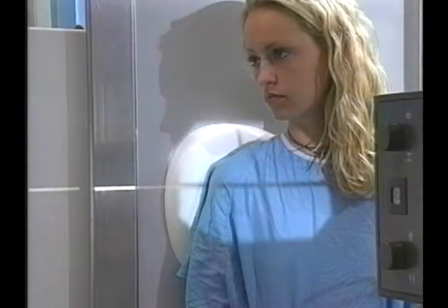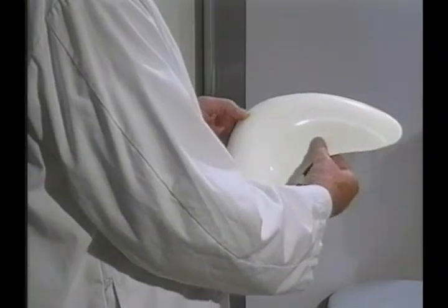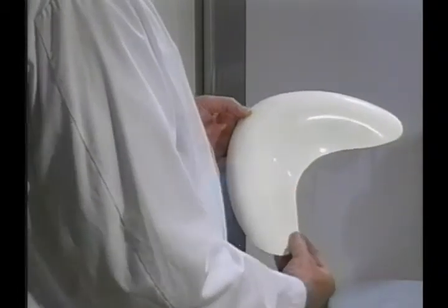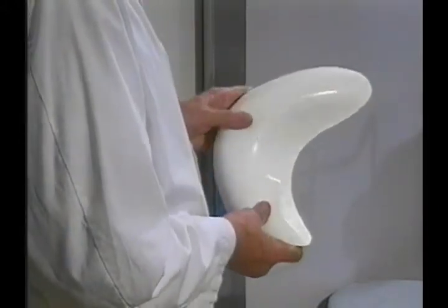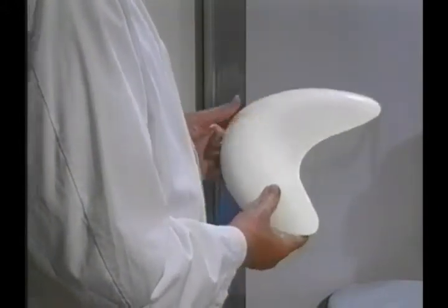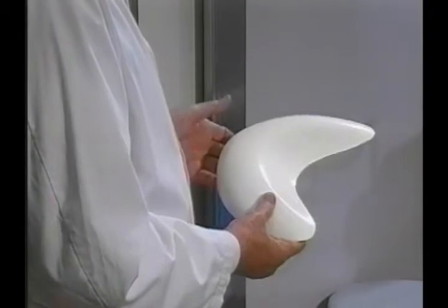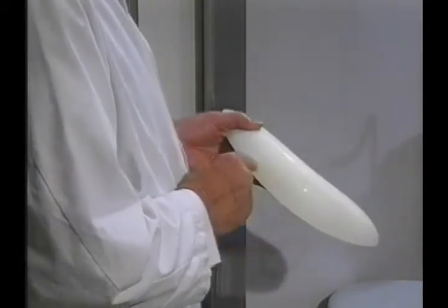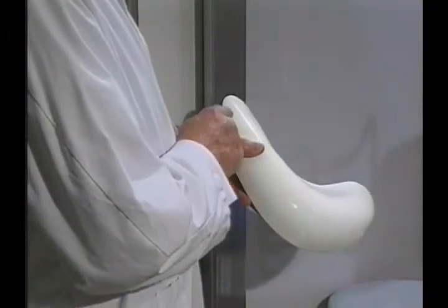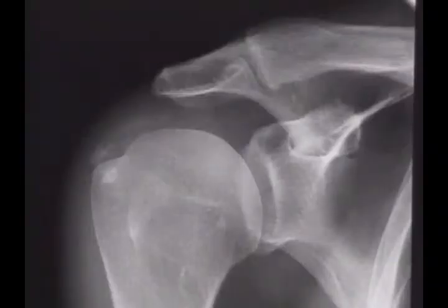The boomerang has a thin wedge and a curve of approximately 90 degrees. It is made of silicone rubber, pliable and harmless. A chain is incorporated at the periphery for medico-legal purposes. The subtle peripheral lesions are much better demonstrated.